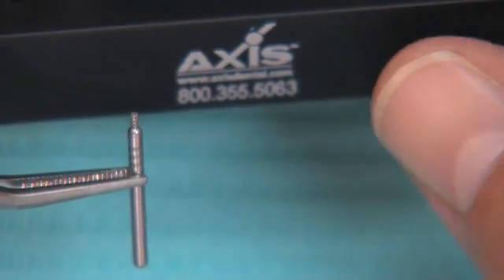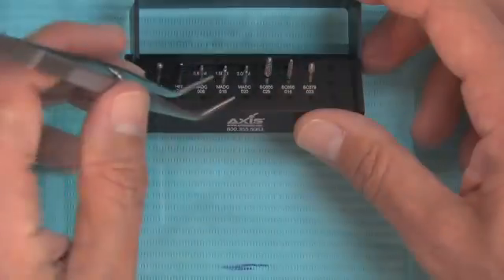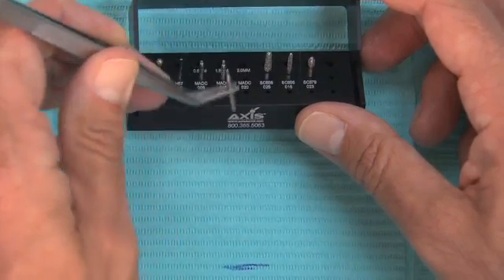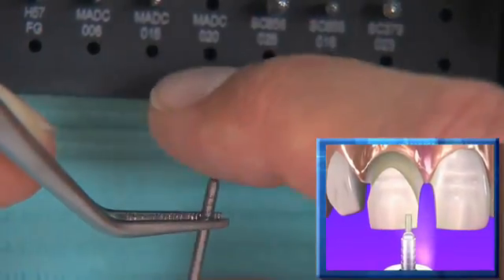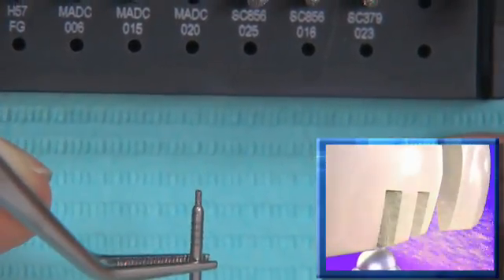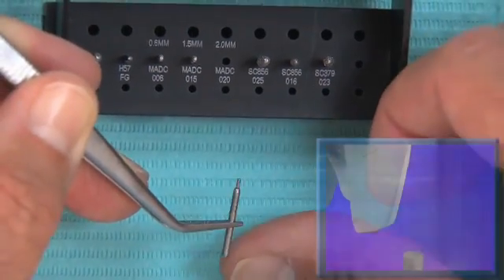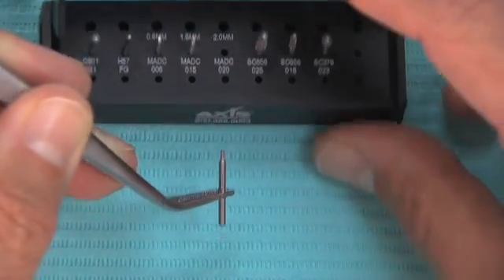In dental school we were taught to do depth cuts with a 330 burr, but the problem is if you push it too far, you risk an endo access. On this 2 millimeter depth cutter, there's no way to put it in too deep — it simply stops at 2 millimeters. That allows you to do depth cuts efficiently: just tap it into the tooth and you've got a 2 millimeter hole. You can see the four rings on the shank — each ring represents half a millimeter, so four rings equals a 2 millimeter depth cutter.